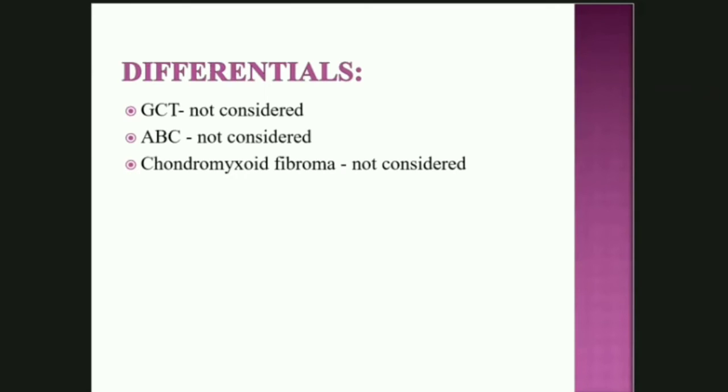And the other diagnosis which we got was eosinophilic granuloma. So somebody had posted that. So it is not eosinophilic granuloma because of the background. Of course the Langerhans cell shows grooving of the nucleus, but the background must have eosinophils, histiocytes. So it's a varied background which is not seen here.